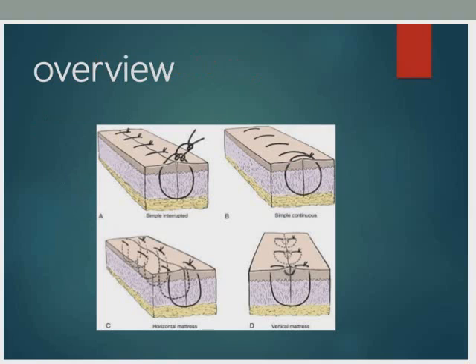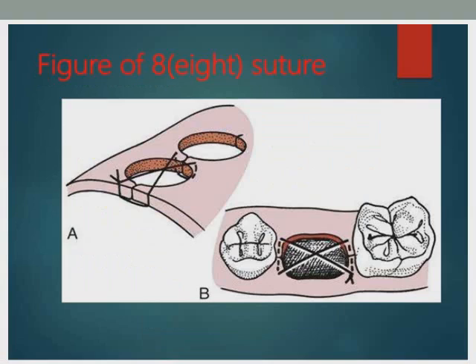هنا overview of vertical mattress suture. عندنا هنا another technique اللي هي figure 8 suture راح نستخدمها for extraction socket closure and adaptation of gingival papilla around the tooth.